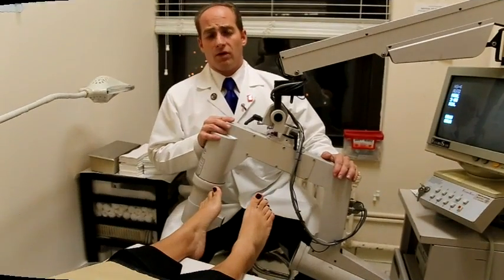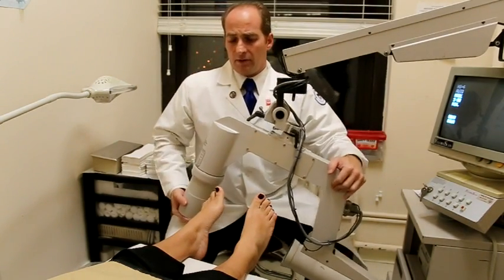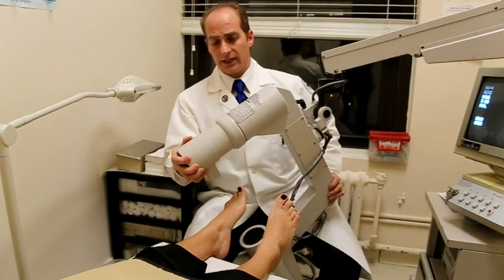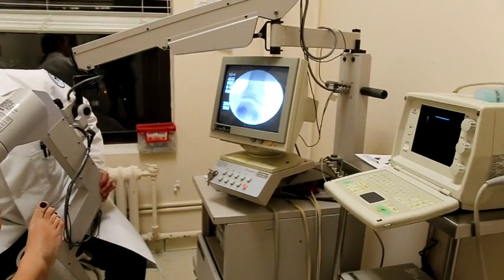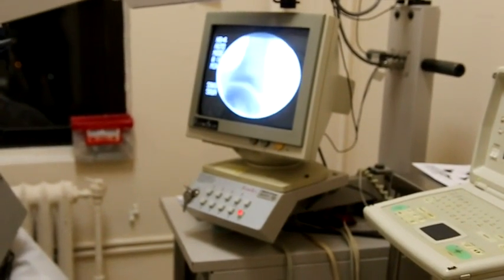So now we're performing our fluoroscopic radiographic examination of both feet, so we better understand the bone structure that we're dealing with. Here we check into the great toe joint. We check range of motion, and it's normal here.